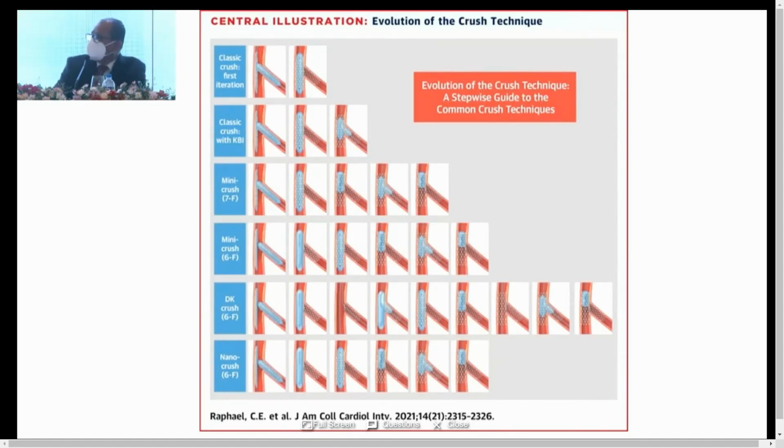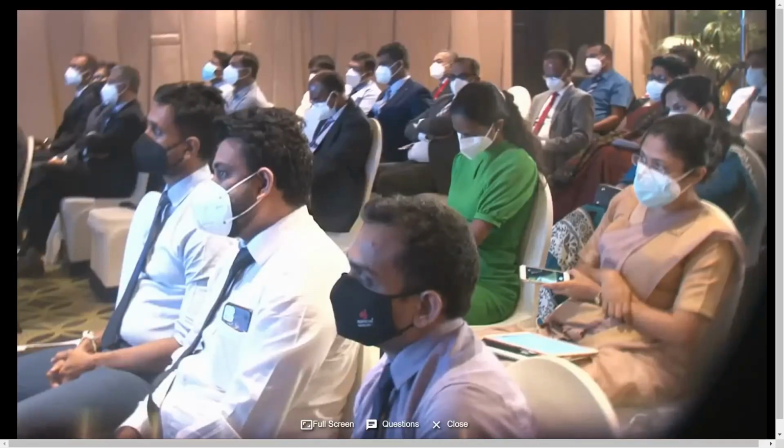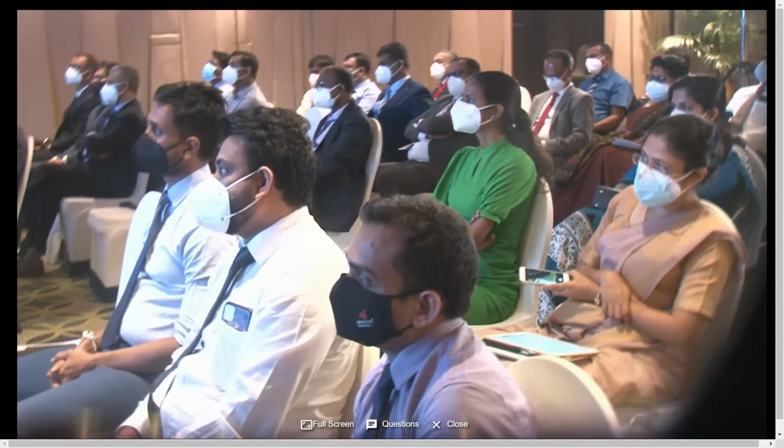But I would like to ask Roshan and Vasanthi to comment on when you decide on upfront two-stent stenting, and when you decide on main vessel stenting with provisional stenting. When deciding to go for main vessel stenting or a two-stent strategy, there are many criteria. Medina's criteria as well as Finet's law we have to apply. And when you have a side branch that you have to preserve, even in an acute primary PCI setting, sometimes you have to go for a two-stent strategy.